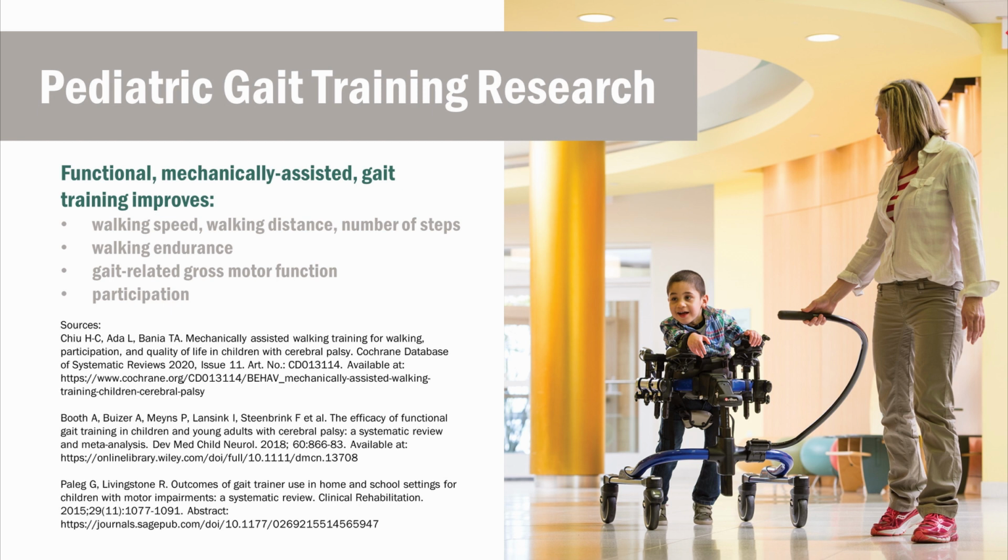So functional gait training is defined as actively practicing the task of walking, be it overground gait training, treadmill training, with or without body weight support, and using devices that may be static or dynamic. In the 2020 review, protocols varied, but typically we saw gait training anywhere from 15 to 40 minutes in a session and doing this 2 to 5 times a week for 4 to 12 weeks.